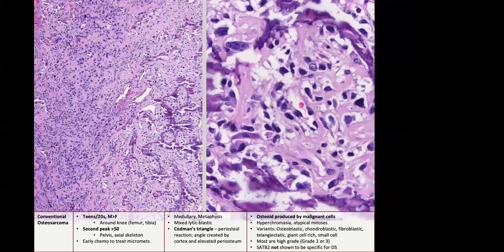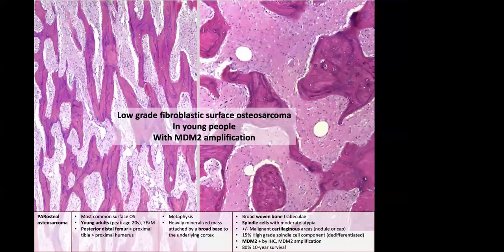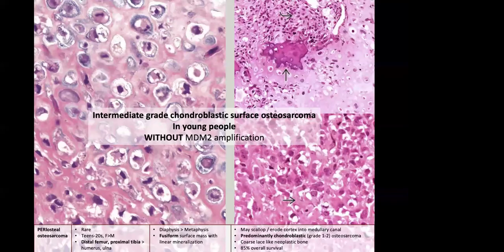The percent of treatment response for conventional osteosarcoma to infer good prognosis is what? Those of you who have signed this out, remember that it's 90% treatment effect is good prognosis. Okay, so there's your slide on parosteal. There's your slide on periosteal.